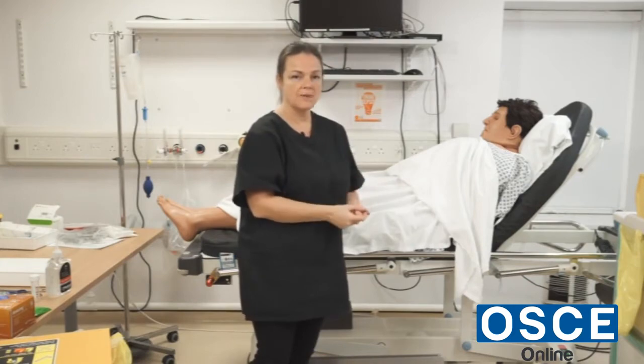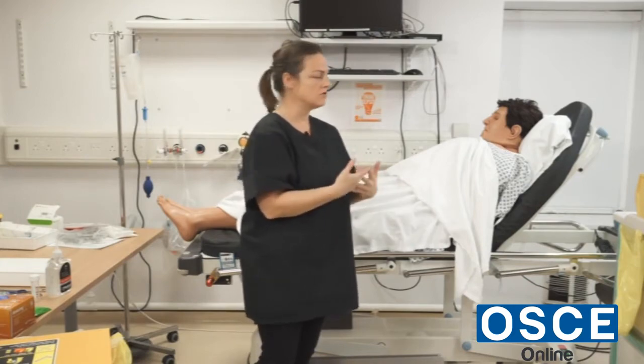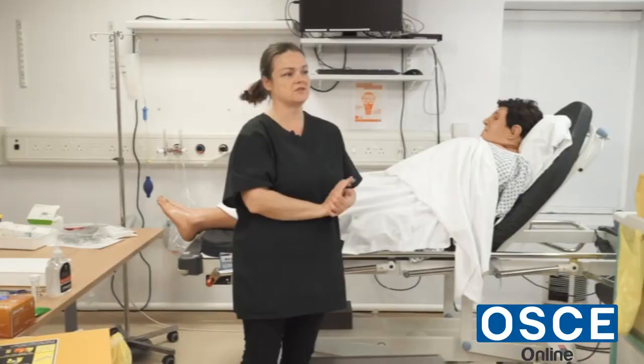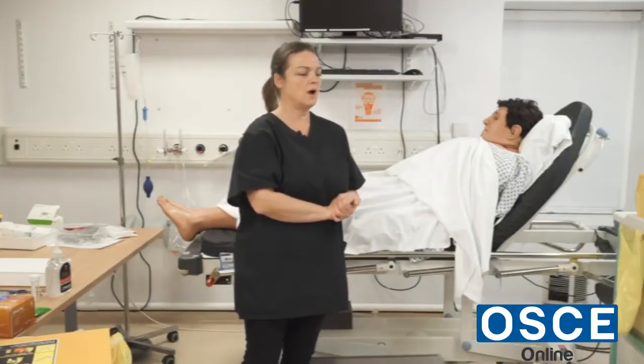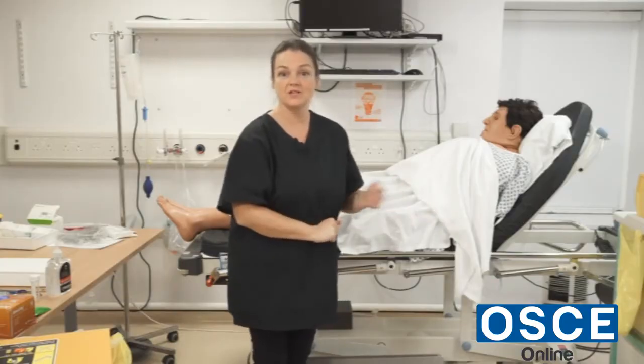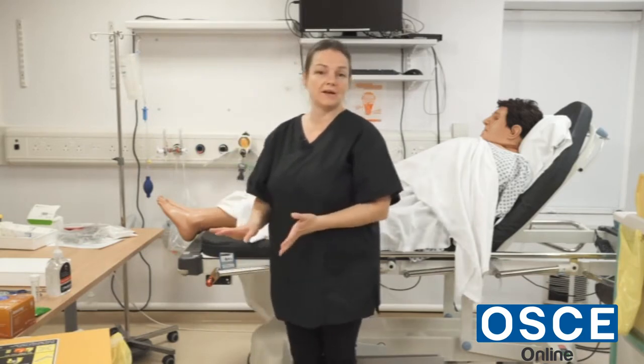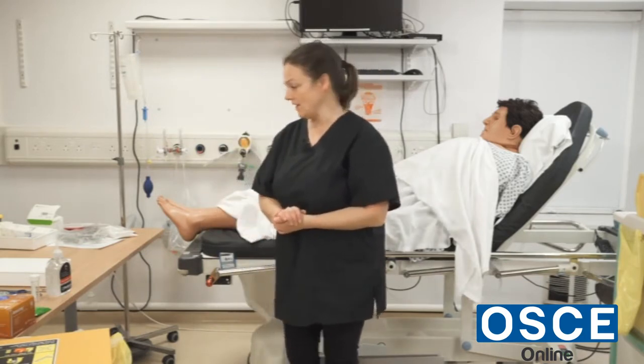I've already introduced myself, checked the identity of the patient — it's all correct — checked the allergy status, ensured they're comfortable, screened the area for privacy and dignity, and explained to the patient I'm taking a sample from the catheter. They were happy with it. So I'm going to leave the patient now and go and get my equipment together.